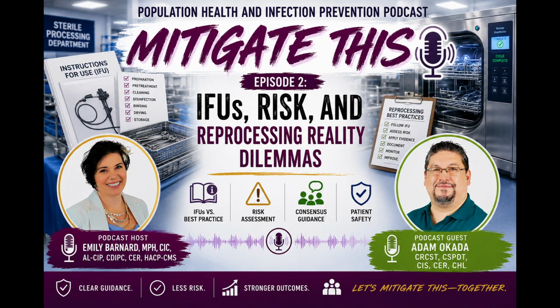Corey Ofstead actually did a really great webinar, which is now on the HSPA webpage, teaching people how to navigate the MAUDE database, because that's a lot of what she did in her research, searching it for those adverse events. And she did a really great job looking at endoscopes over time, and you could see the prevalence increase of a lot of these different medical device failures or cleaning errors or different opportunities over the life of different scopes.